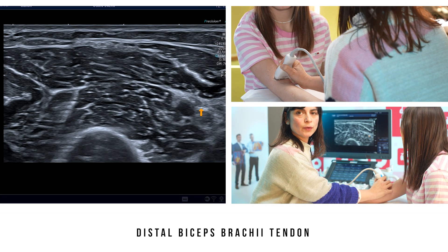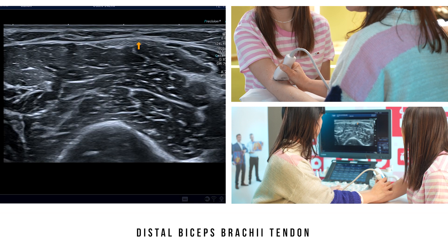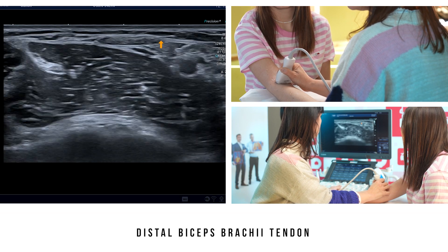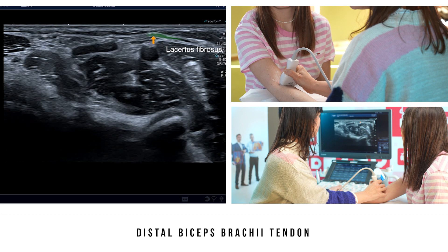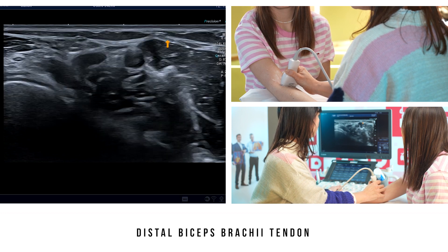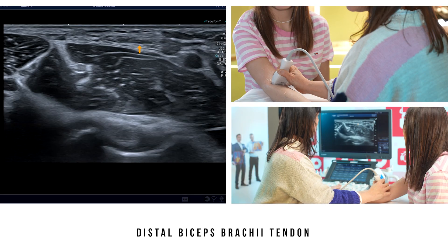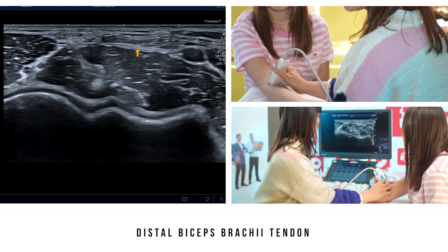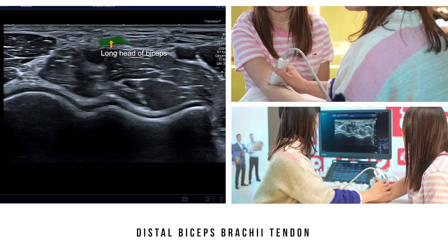To analyse the distal tendon of the biceps brachii, I suggest starting with an axial section of the musculotendinous junction. At the musculotendinous junction, we can identify a thin aponeurotic expansion — the lacertus fibrosus — that starts on the medial edge of this junction and will cover the neurovascular bundle of the median nerve and the brachial artery, terminating on the antebrachial fascia. Staying with the axial section proximally, we can use small movements to play with anisotropy to see the two portions of the biceps tendon: the short head on the medial side and the long head on the lateral side.